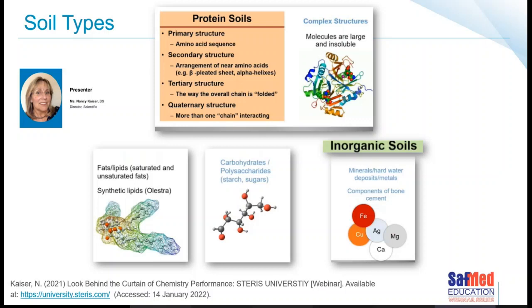We need to take into consideration what soils our devices are exposed to, because we have to have the right type of chemistry, the right formulation, to break down those particular soils. If you're washing your laundry, the Omo, or whatever the correct terminology is for a laundry soap, has particular chemistry and structures in it to deal with the things your clothes are exposed to.